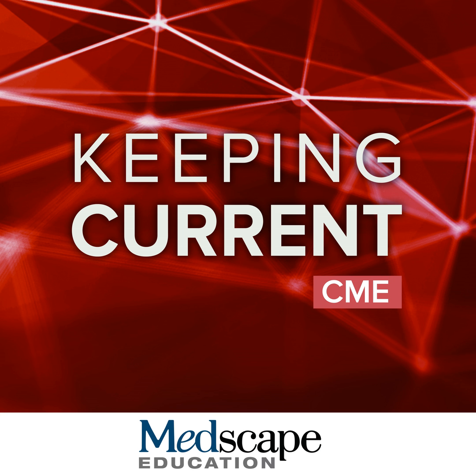Now, a number of studies have been done on dosing of contrast for cardiac MRI, and one of these compared a single dose of a high relaxivity contrast agent to a standard agent given as a double dose. You can see that there were really no differences in visualization of the myocardium, quantification of parameters between the two techniques, as well as signal to noise and contrast to noise. As mentioned, however, if you do use a single dose of contrast, it is recommended that you image a little bit earlier at 10 minutes, compared to if you use a double dose of contrast, you'll image a little bit later at 15 to 20 minutes. So you need to bear that in mind as you structure your protocol.